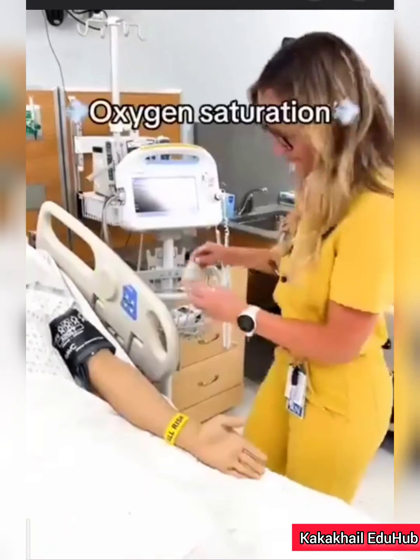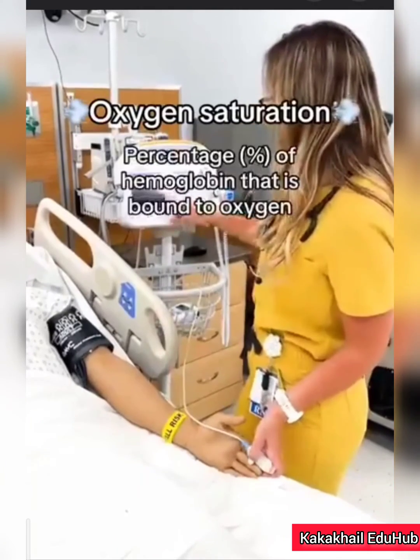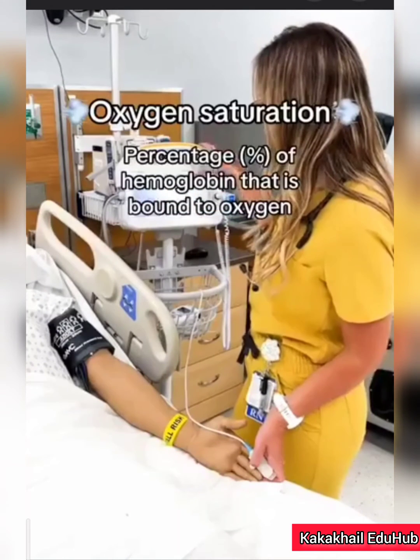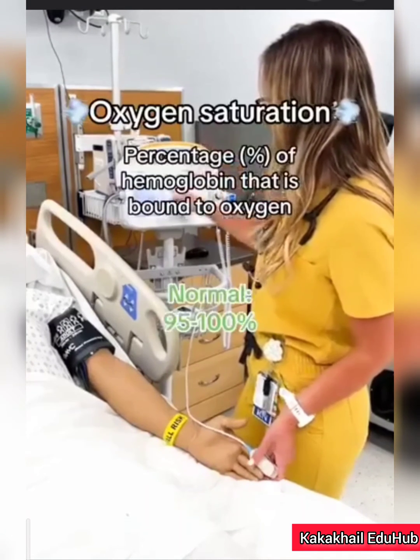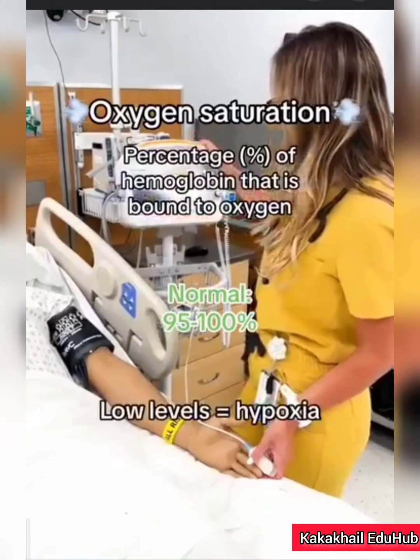Next, we have oxygen saturation, called SaO2. This is the percentage of hemoglobin that is bound to oxygen, which is measured with a pulse ox. A normal oxygen saturation is 95 to 100%. Low levels would indicate hypoxia.